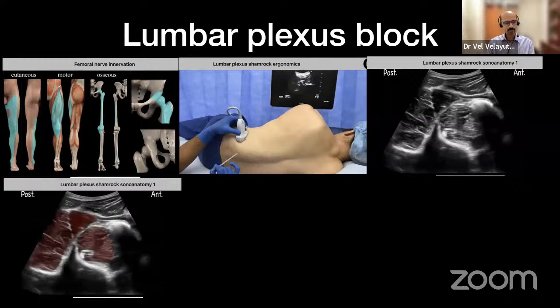In terms of labeling, you want to see this finger pointing structure. So you're sort of pointing your probe at a lumbar vertebra. This is one half of the lumbar vertebra. So the patient's lying on the side. So this is the anterior part, this is the posterior part. So you're seeing the vertebral body, and that pointy bit that comes across is called the transverse process, and then you've got a spinous process going behind, and you see three muscles along it. So in this picture, the muscle in the front is psoas, this one is quadratus lumborum, and this big muscle, combination muscle, is erector spinae.